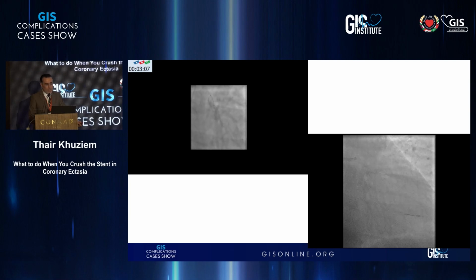And even here, if you look to the balloon, it seems behind the stent. And we decided to cover that area because now the proximal part of the stent, we went behind it, then we went inside the stent. So we dilated that part, and we decided to cover it by stent.